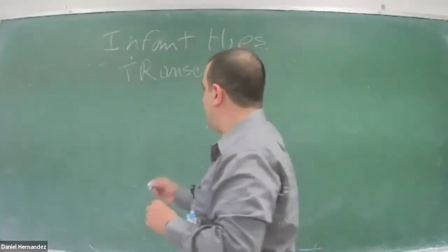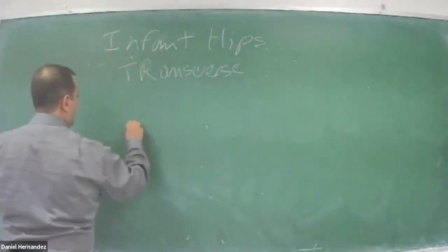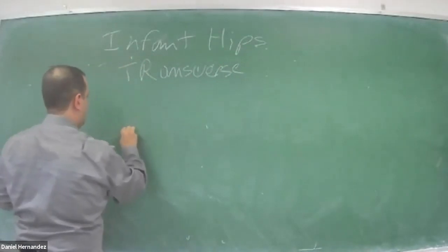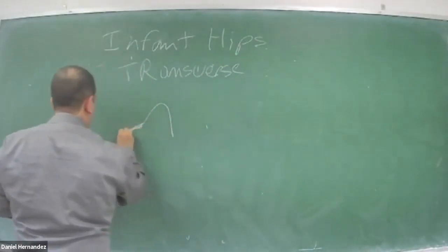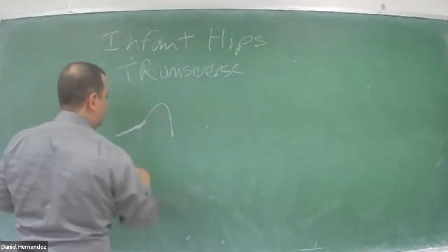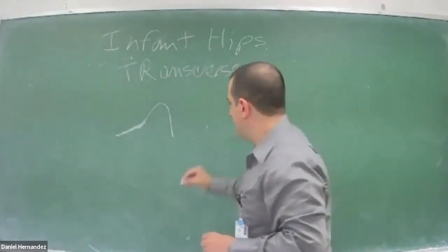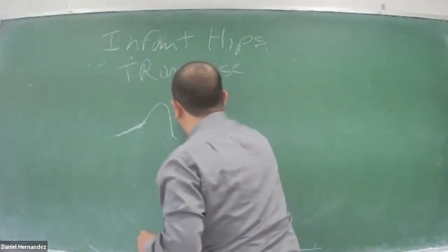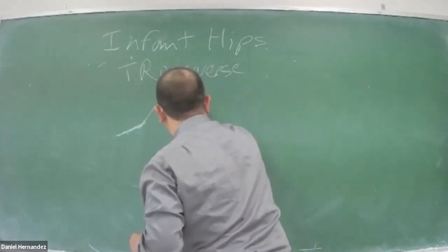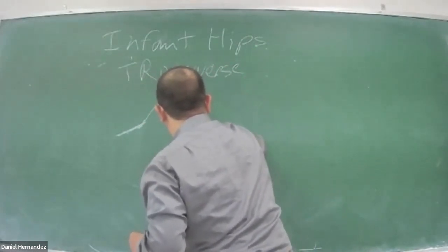So with this view, we have our femoral shaft coming in, and our femoral head sitting here.